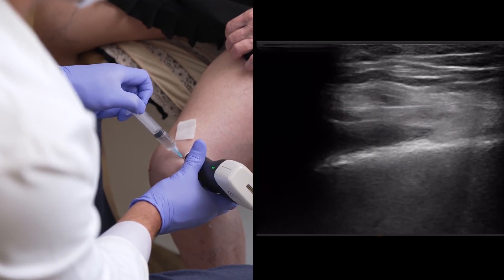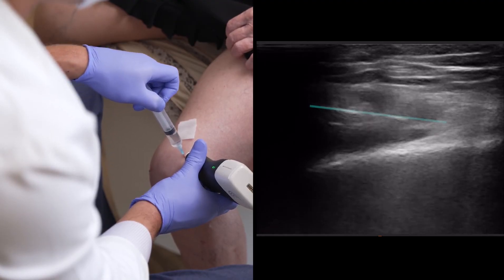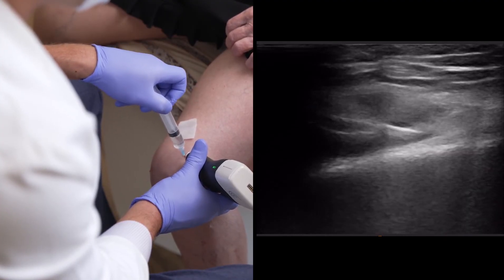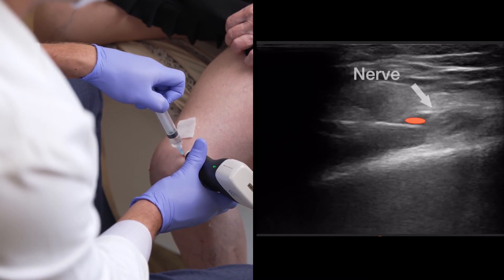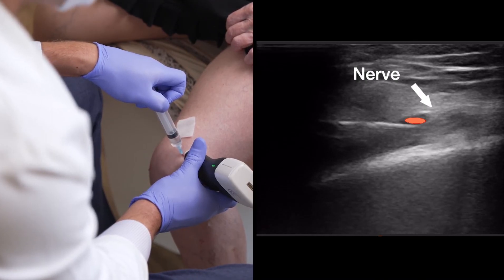The nerve is on top of the artery. I'm going to get the needle slightly lower, and you have to target the nerve underneath it. That's the nerve right above my needle. The artery is to the left of it. Much easier to see after the local anesthetic has been given.